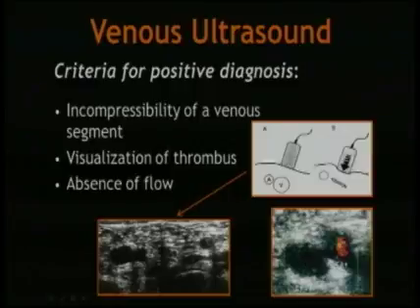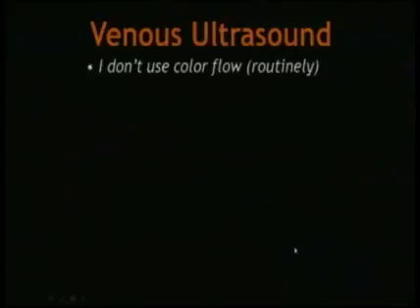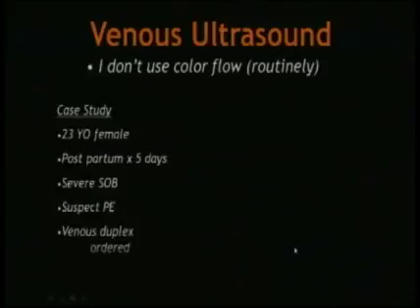We see evidence of color flow within the lumen of the artery. However, there is an absence of flow within the lumen of the vein, and we can see evidence, B-mode evidence, of thrombotic material within the lumen of that vessel. The combination of those three factors gives us a high level of confidence for a positive diagnosis. This patient is positive for deep vein thrombosis at that level.